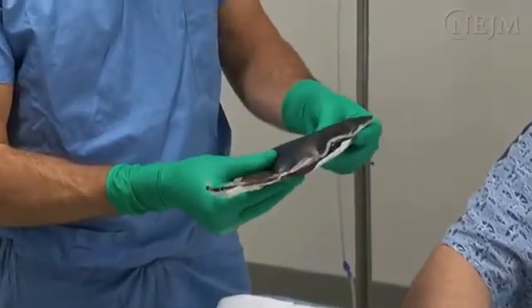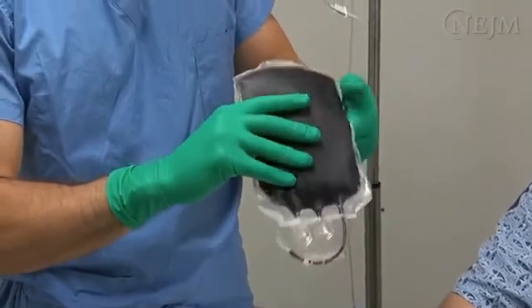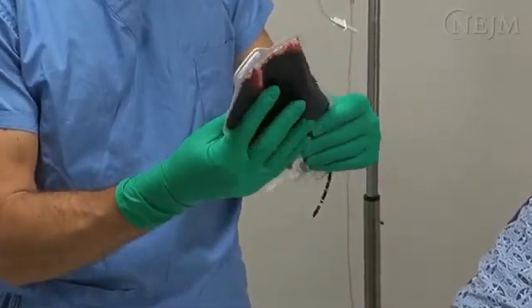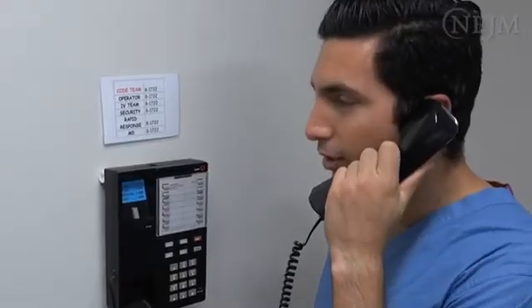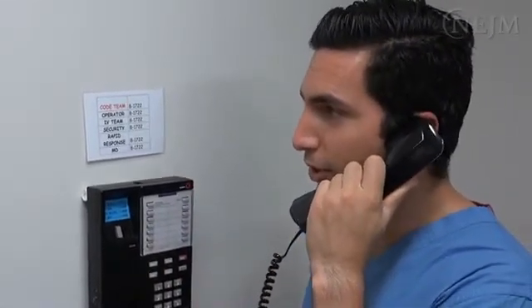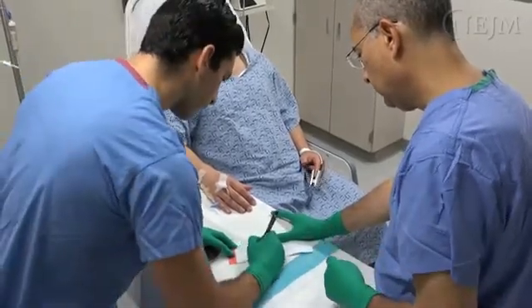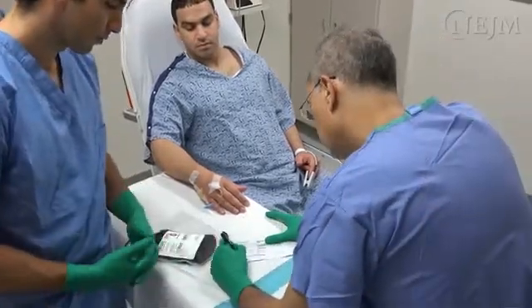Examine the red cells. If there are any discrepancies or if the blood has an abnormal color or odor, clots or excessive air in the bag above the cells, or signs of leakage such as a blood smear on the bag, notify the blood bank and wait until the issue has been resolved before proceeding with the transfusion. Once all information has been verified by you and the other care provider, both of you have to sign the tag on the blood bag before starting the transfusion.